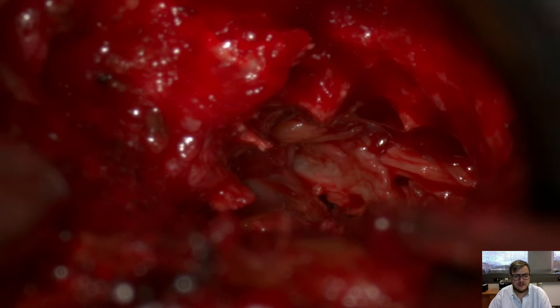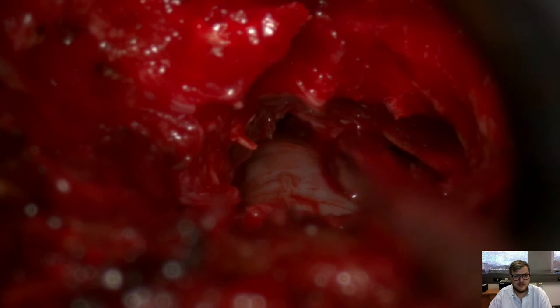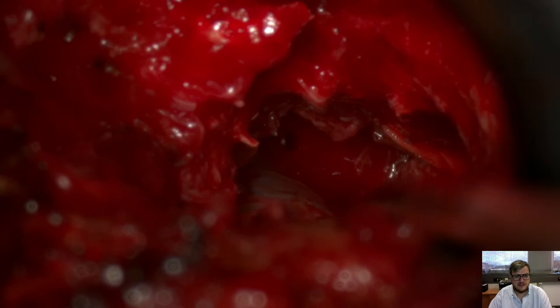You see the disc herniation that is removed in two pieces. And you see the nice decompression that is possible by using this minimal exposure.